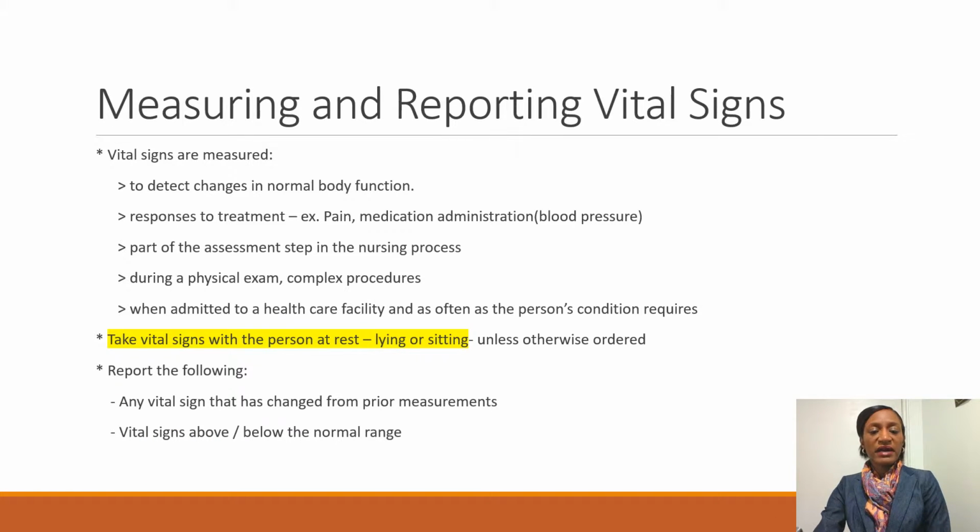Measuring and reporting vital signs. Vital signs are measured to detect changes in normal body function. They represent responses to treatment, such as pain management and medication administration, particularly with blood pressure management.